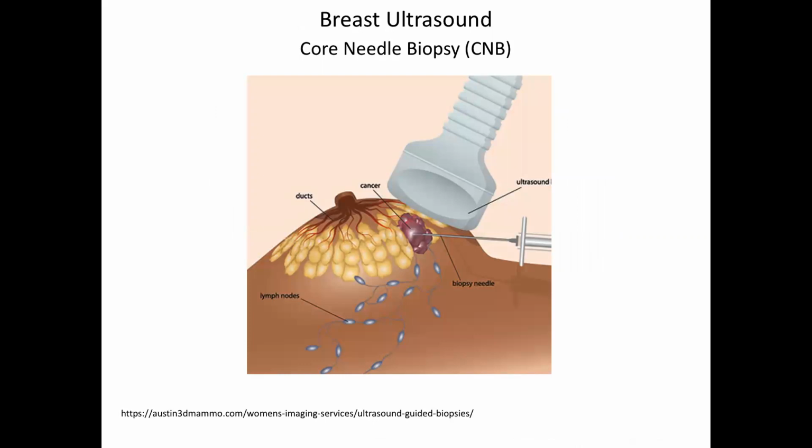Okay, so we're going to look at ultrasound guided biopsies and ultrasound guided wire placement for surgical planning. And it's really simple, right? The way it's done, but it's hugely, really effective. And that is usually a tech or the physician has the ultrasound transducer in one hand, is interactively looking at the tumor. So she has the target in place. And then you just push the needle and you look for the needle in the ultrasound, right? And get the right spot.